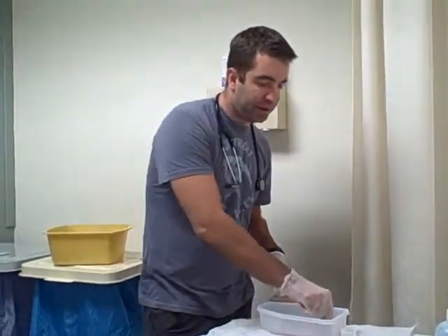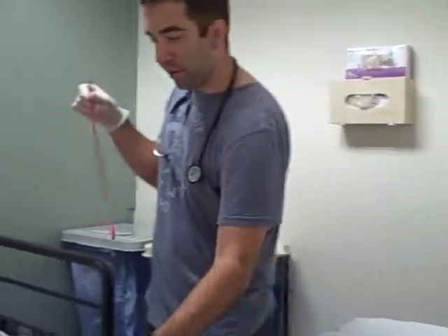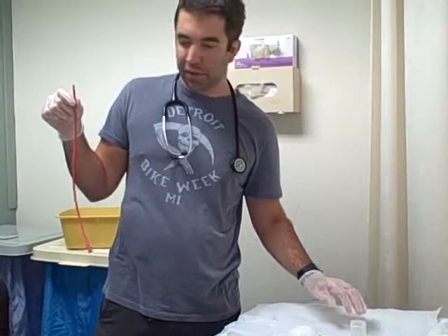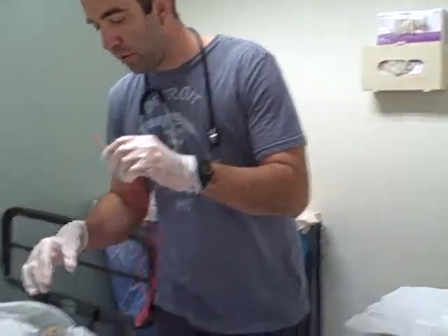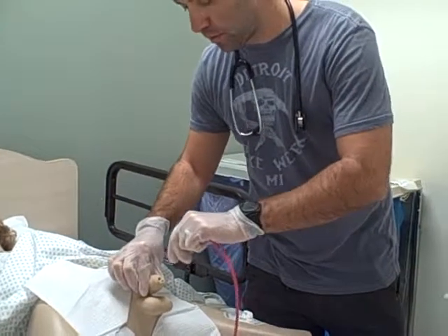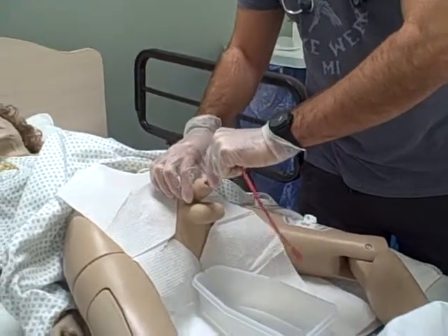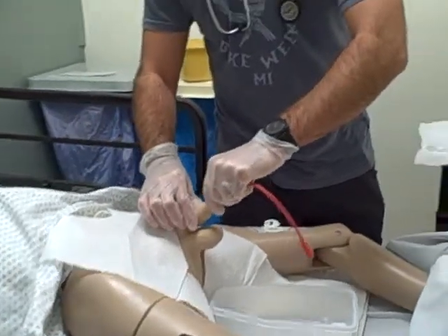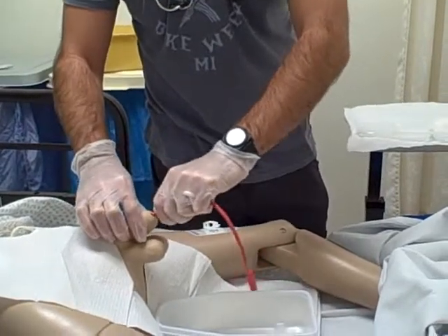Next thing I want to do is take my catheter out, put my basin underneath the penis for the urine, and I have my specimen cup here waiting ready for me. So I'm gonna take the tip of the penis, insert the catheter, till it doesn't go in anymore. In real life I'd be getting discharge right now if I was all the way into the bladder.